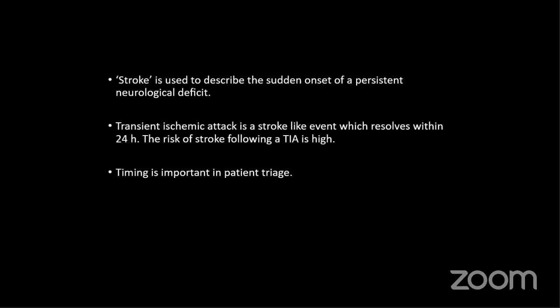So a patient comes with a sudden focal onset like weakness. Your requisition will just show right-sided weakness or left-sided weakness for 1 day, 2 days, or a couple of hours. This is the most asked requisition for the MRI brain.